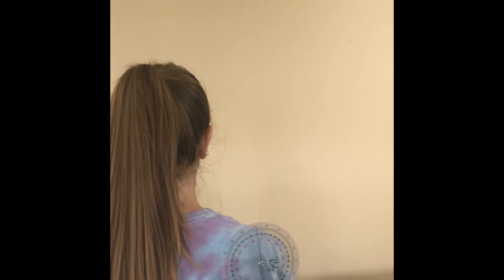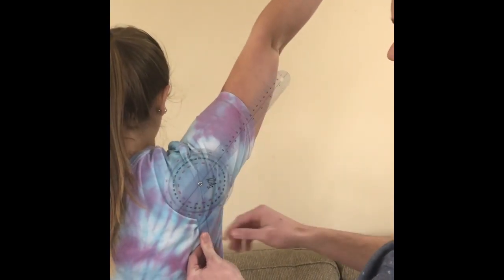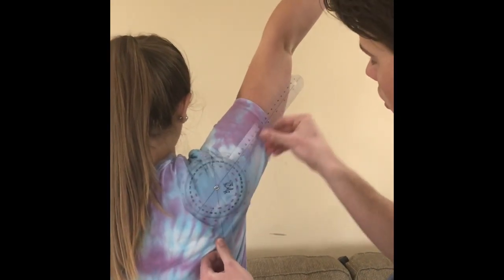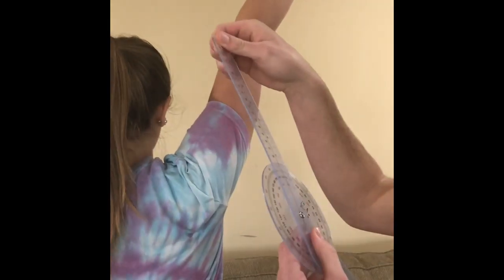When the time is ready, you're going to ask your patient to raise their arm laterally as high as they can, and make sure that they're going as high as they can before they start recruiting other muscles. So right about there is when they start recruiting other muscles, so therefore the rotation is over. Make sure it's all lined up properly, and it is 145 degrees of motion.